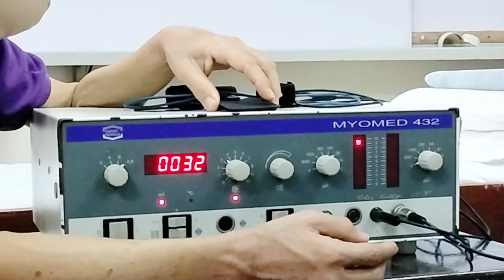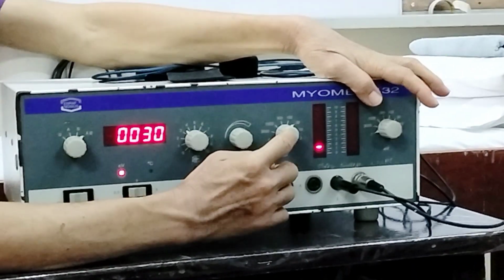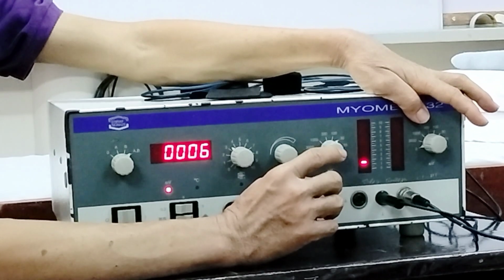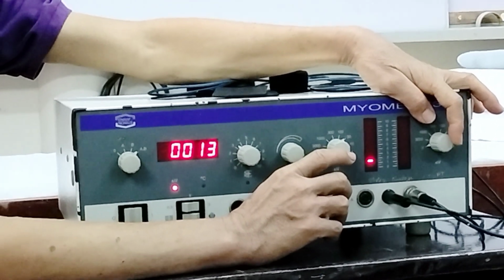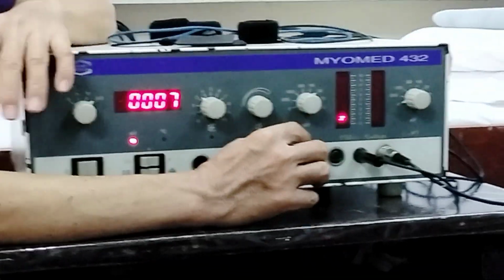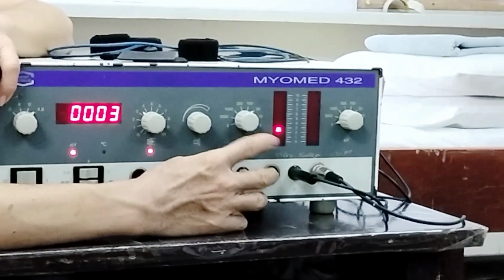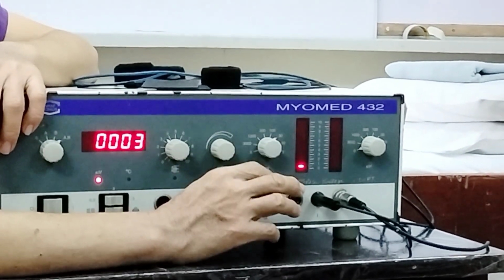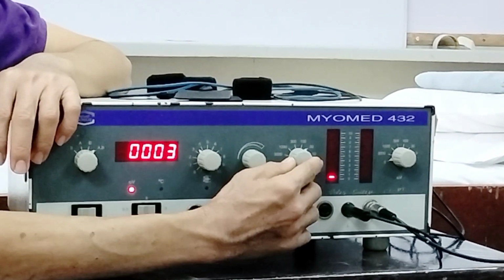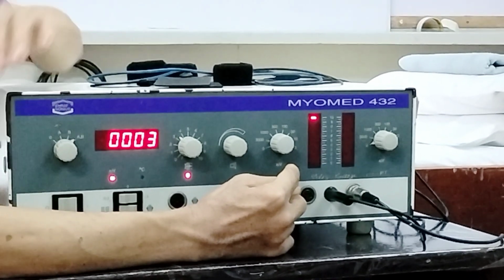Okay, next here. These two knobs, this is for channel A, this is for channel B. You have two channels. This knob will adjust the sensitivity of the machine. If you look there, you have 0, 3000, 1000, and further to 3. The unit of this value is microvolts. If you choose 3, that indicates that the machine is very sensitive.